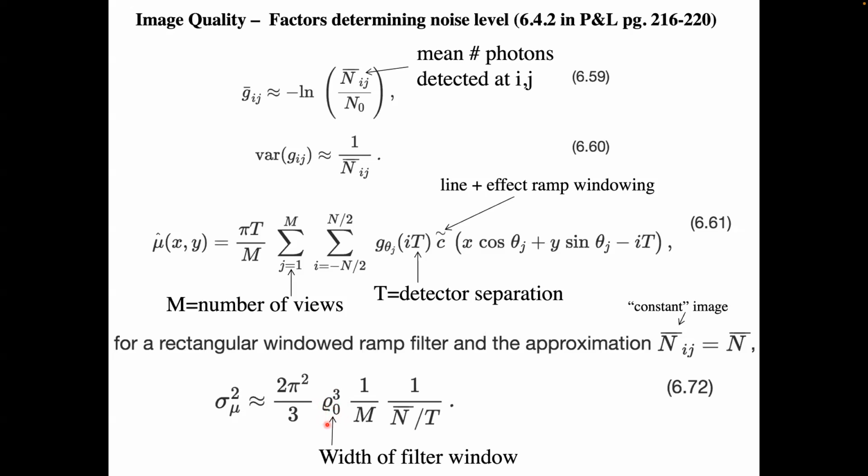This is the width of the ramp filter. Okay, the width in frequency space of the ramp filter. So remember, we looked at using that ramp filter up to a certain frequency bandwidth and then cutting it off and saying that's it. And we'll do the inversion of the data using that ramp filter. So this is an indication of how wide that ramp filter is.